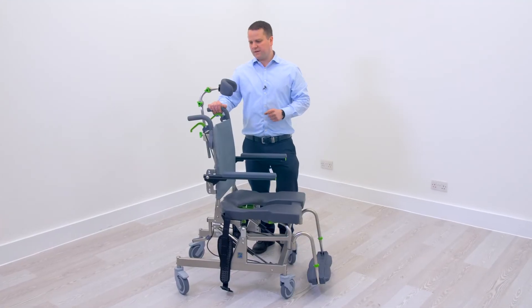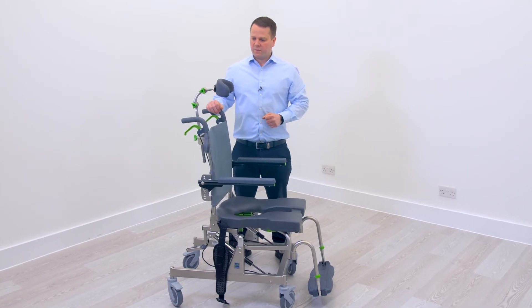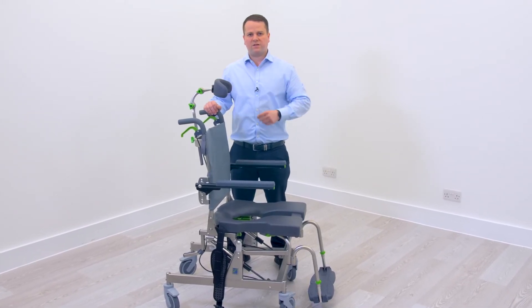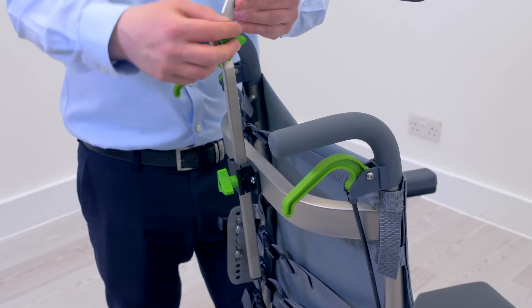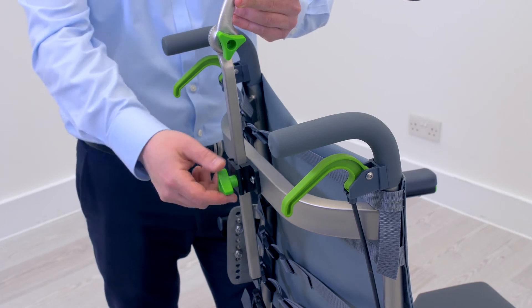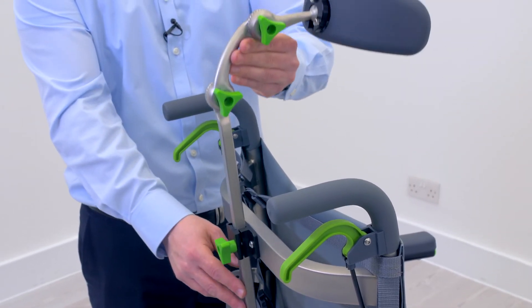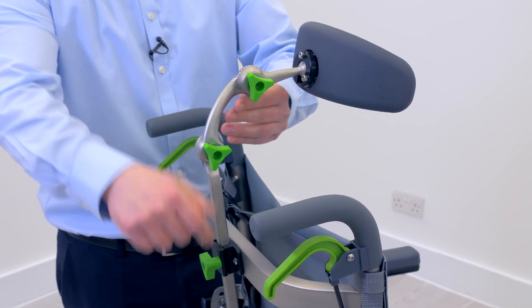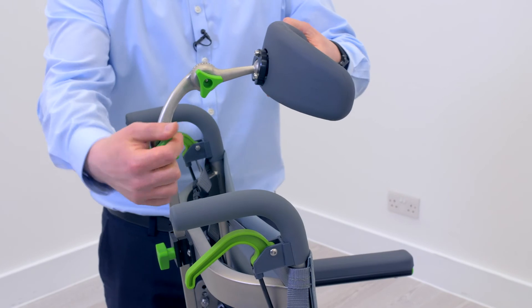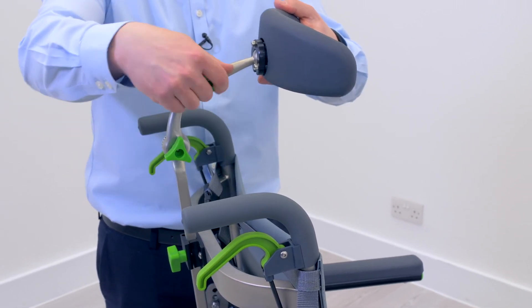Once that's done, you can then also reposition the head support. We want the headrest in the correct position, especially when the chair is tilted. With that, we have height adjustment — adjust the height of the headrest — and also depth adjustment, so we can move the headrest backwards and forwards into the correct position for the user.